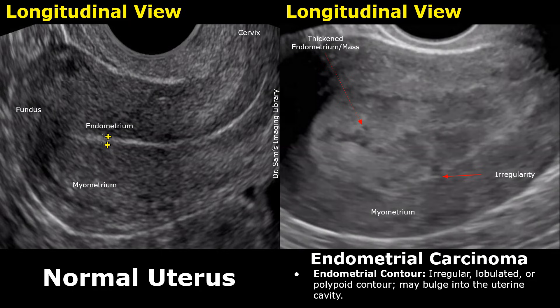You can see these irregular borders of the mass, and it also has a heterogeneous appearance which indicates carcinoma. This area is more irregular and indicates myometrial invasion — another feature of aggressive disease.